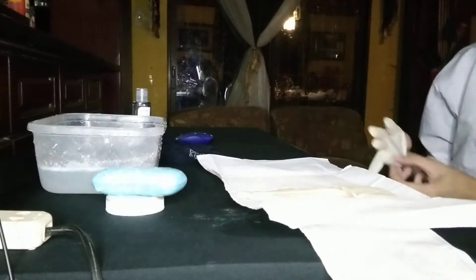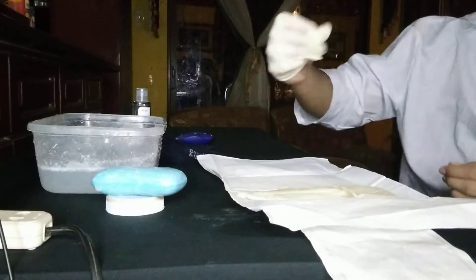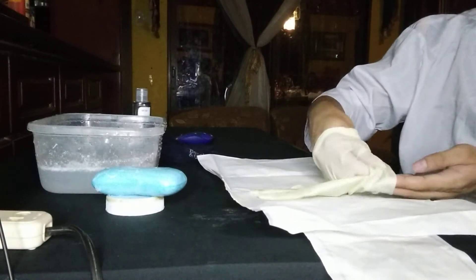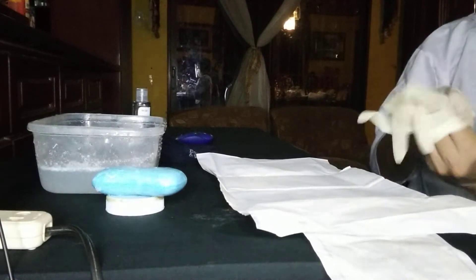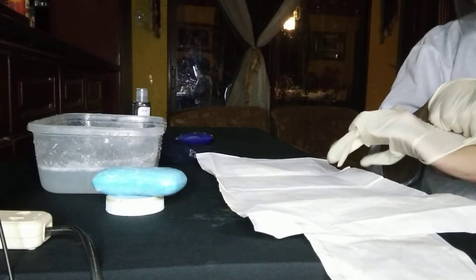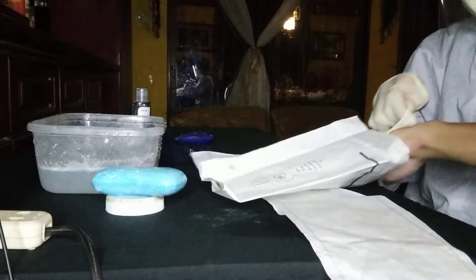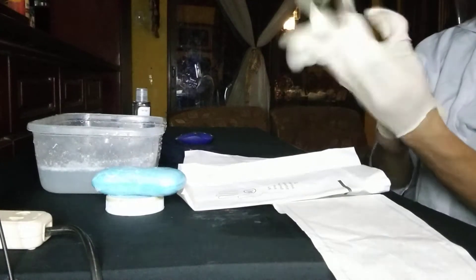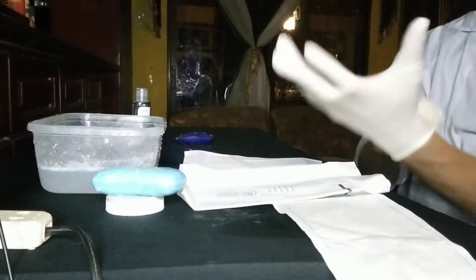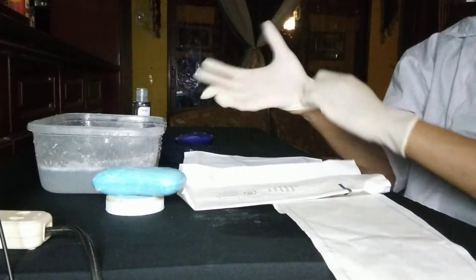Now your right hand is sterile, so use your right hand to pick up the left glove and make a pocket to slide your left hand in. If the glove does not go on straight, adjust it and release.